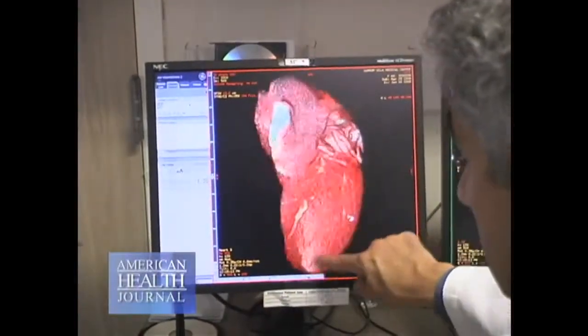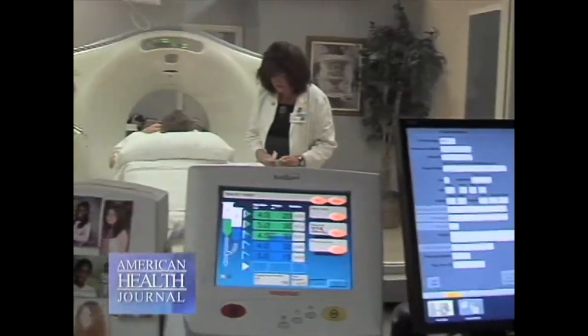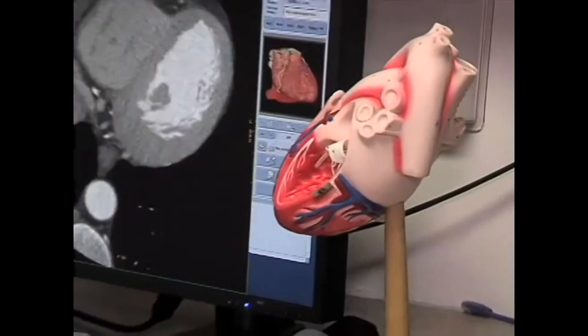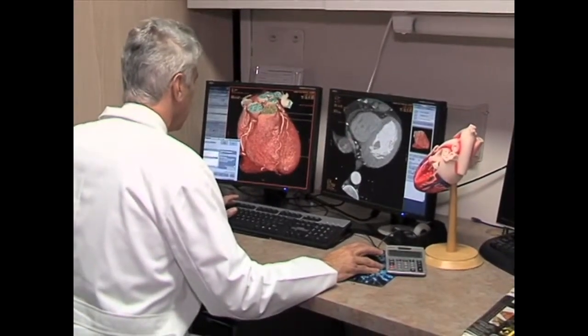Dr. Budoff, where are you today in this research? We're in a very good place right now. Calcium scoring, the calcium score, that's very low radiation, that affords us a quick look into the heart for plaques. How much plaque do you have? Gives us the best way known to identify patients who might have heart disease. So it's the best predictor of future heart attacks known, and it's now recognized by the American Heart Association, the American College of Cardiology, the European societies. It's paid for by about half the payors now, not all of them, but it is a well-recognized test for the detection of silent heart disease.